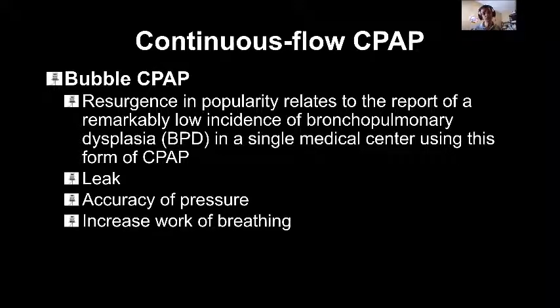And bubble CPAP has gained lots of popularity in recent years. And I'm sure some of you know that medicine is like a fashion. It's like a hairstyle or dressing. Some things go up, and suddenly disappear. So bubble CPAP gained momentum in the last years. The reason is that we have lots of bronchopulmonary dysplasia in neonatology, and people are trying to do many things to prevent it. And there are many centers that think bubble CPAP can prevent bronchopulmonary dysplasia.